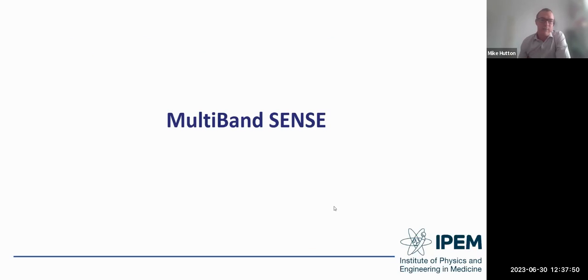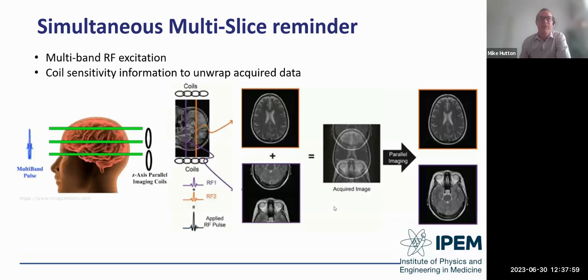So I'm just going to start now by going through a bit of the basics of these different techniques and then the Philips implementation of the techniques. So starting with multiband sense.